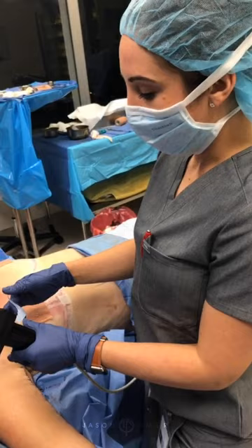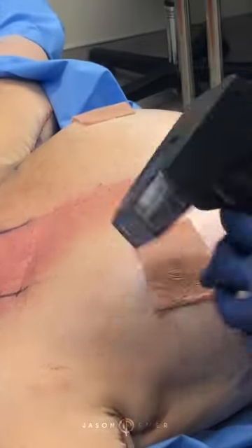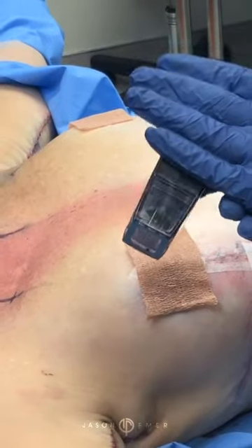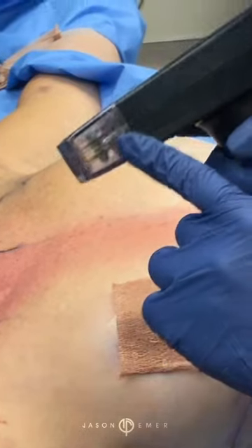We're using it for our patient here on her chest. She's had some work done surgically, and so this is going to be our next step in tightening the skin. This is penetrating 4 millimeters of depth.